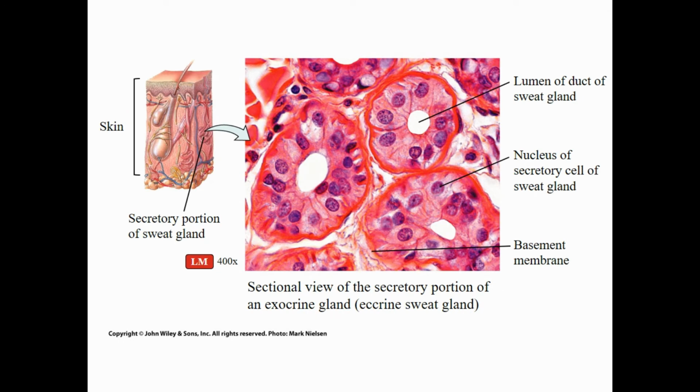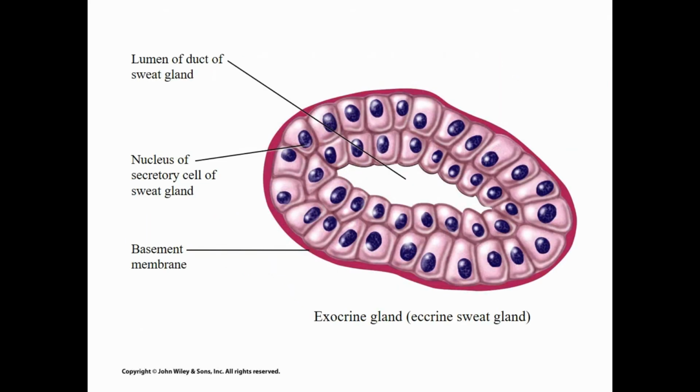And we move on to the sweat gland. So we're talking about the tissue that's in here. We see one row of nuclei here, but this is kind of jumbled up, and it kind of looks as though there's multiple. So the real picture of this one is tricky, but in reality, there are multiple layers. So we're going to go with this being stratified cuboidal.